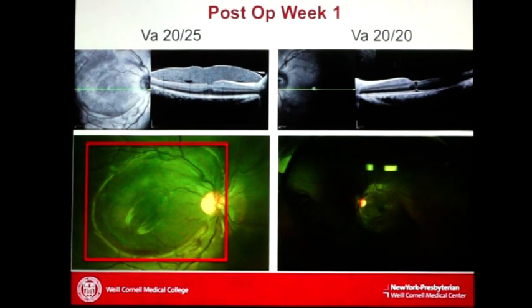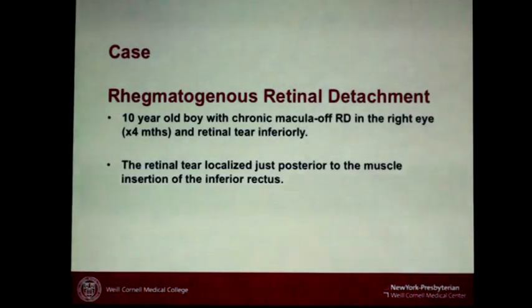Okay. Here, I always complement my imaging also with OCT. You can see here the little pocket, a little burst of hemorrhage underneath. Great example of preoperative and postoperative in a scleral buckle case.